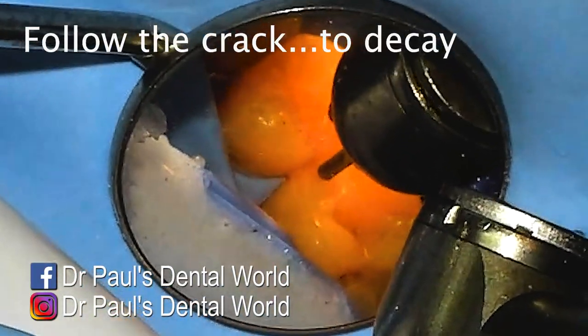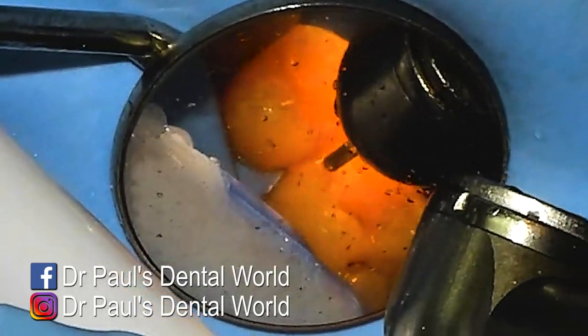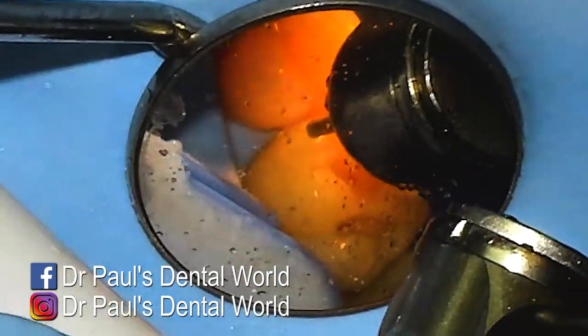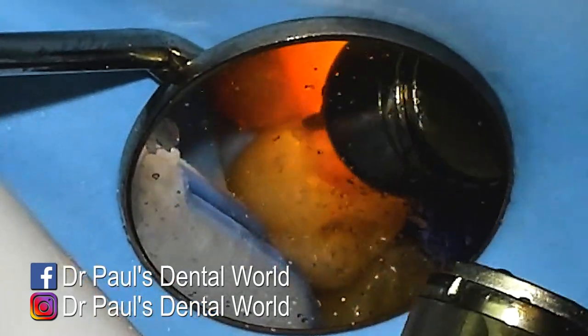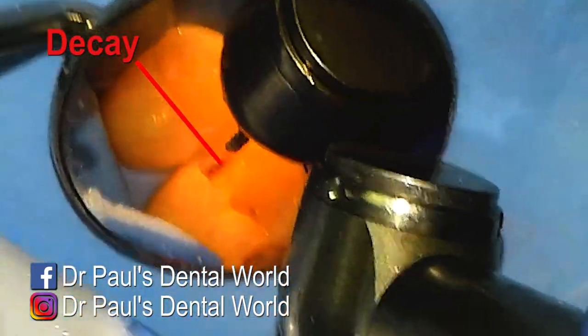Now it's time to remove the decay on the front half of the tooth. Whenever I do this, because I'm not exactly 100% sure where the decay is, I always take it quite slowly and do it quite conservatively. I want to make sure that the area I'm drilling actually lines up with where the decay is, so I'll always go in until I can first see that brown area, which is the decay.